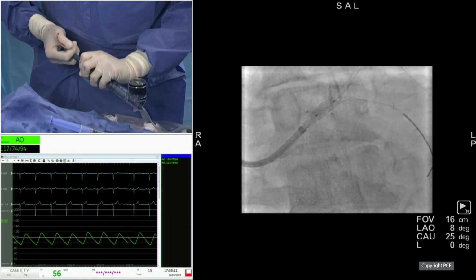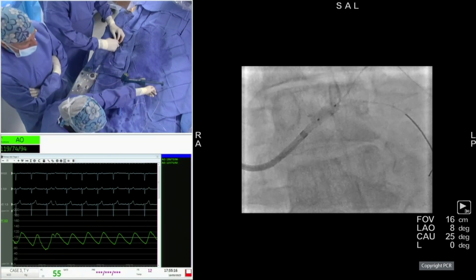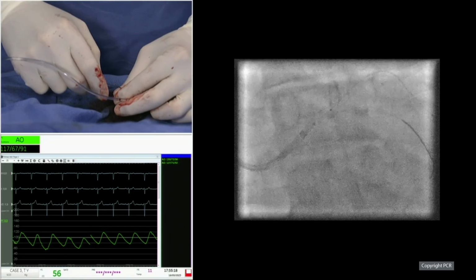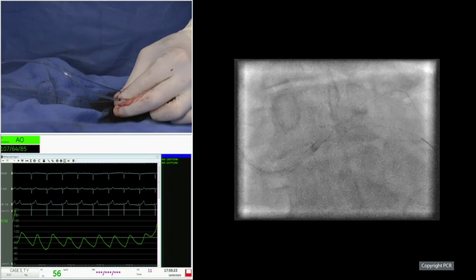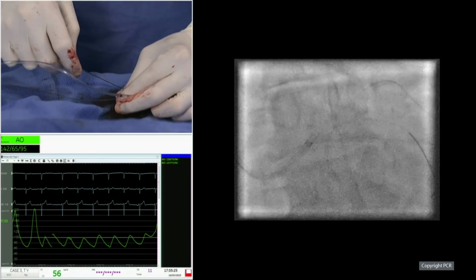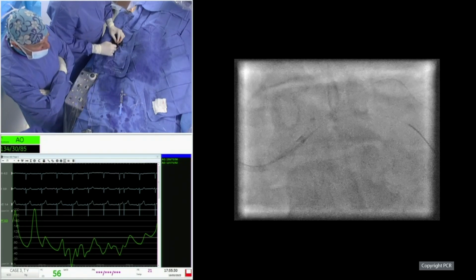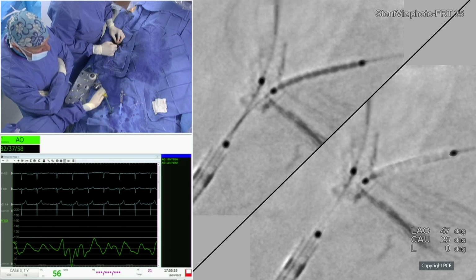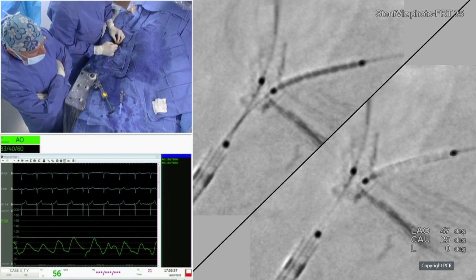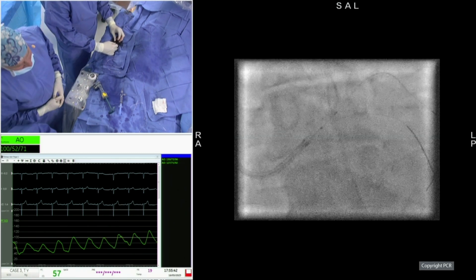By OFDI, yes. My feeling, but maybe about my eyes are telling me that maybe the stent of the left main has been a little bit crushed when we advanced the stent of the circumflex. It's my personal eyes, but maybe can you advance the balloon back? And I want to do a StentVis. We will compare to the previous StentVis, but I have the feeling that maybe the stent, despite our effort, let's see. Sorry, but it's my eyes that are speaking.